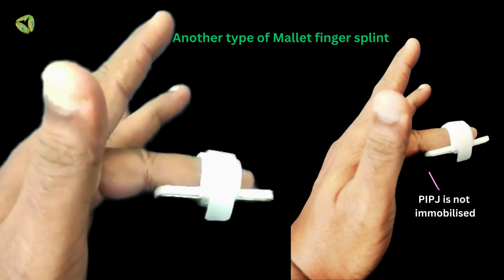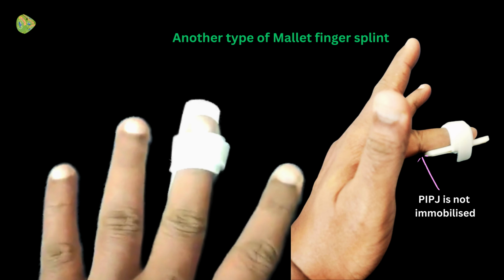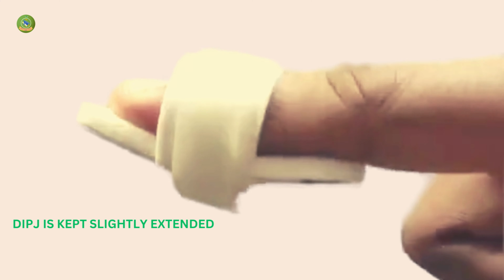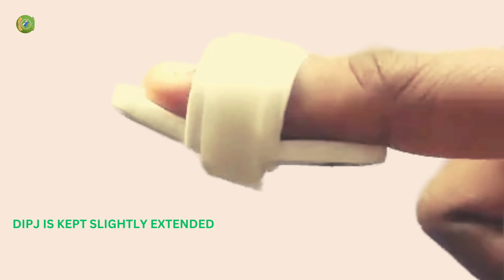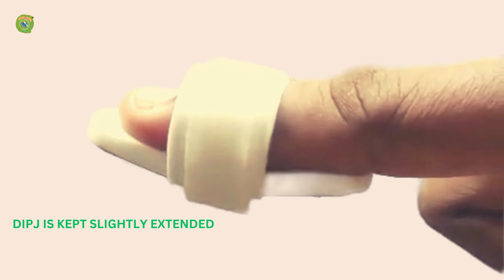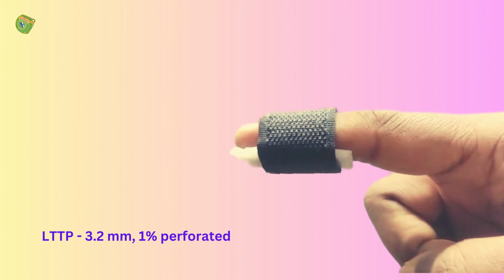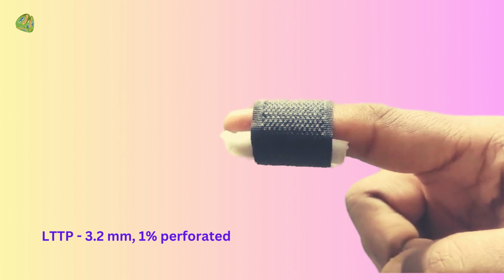This is a soft padded aluminum splint with velcro straps used in the mallet finger treatment. Here a slight extension is provided to the DIP joint. This is another type of splint made with low temperature thermoplastics. Perforations help in ventilation.